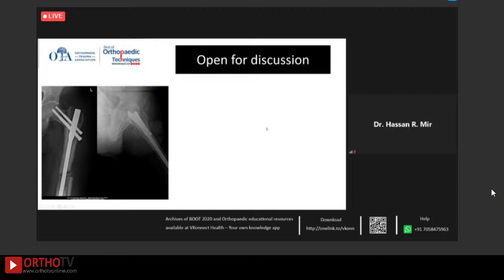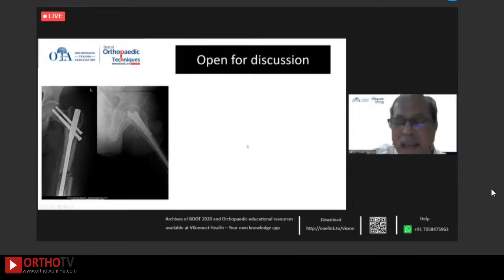So how far out is this now? It's about eight months after injury. Eight months. Yeah, so the problem here is that it was nailed in varus, right? So I think you've got to not just look at the femoral shaft here, because the femoral shaft is easy, right? You work it up for infection, maybe aspirate it if you have concerns. I would definitely do a metabolic workup because femoral shafts generally do heal unless their vitamin D is very low. So I typically replace their vitamin D as well. Although the jury is out on whether that matters, I don't think it can possibly hurt.